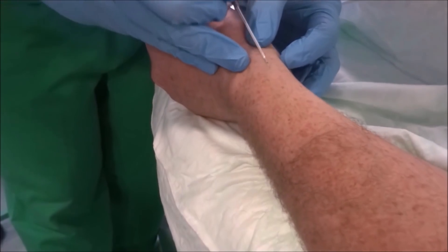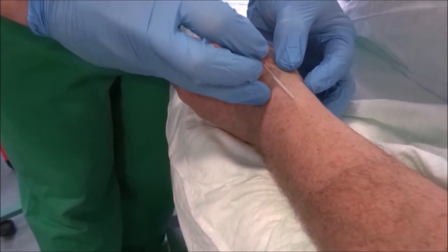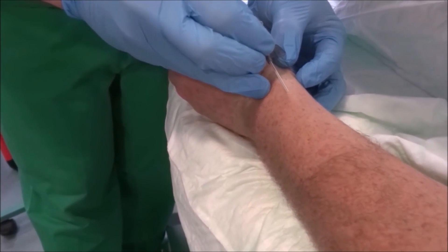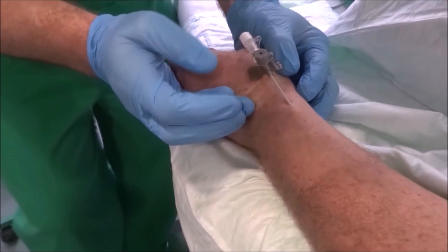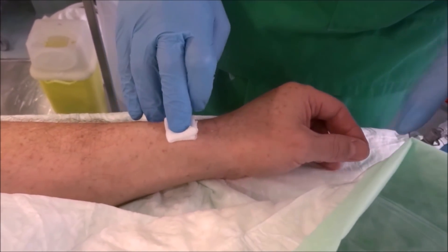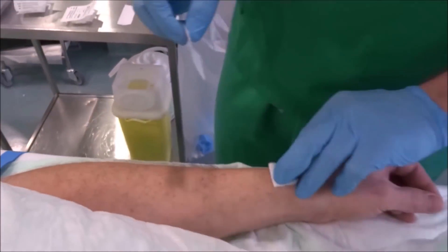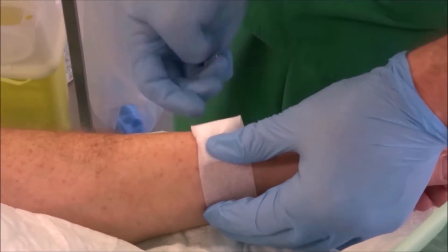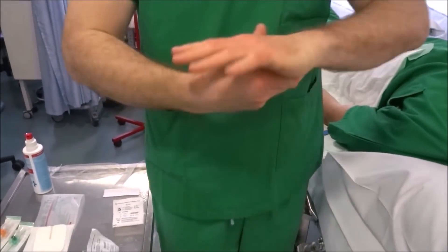We now insert the catheter. Here, we have to stop the process because the patient complains about sensory disturbances in the thumb. The strong twitching after the puncture also indicates the touch of a nerve. It probably touched the superficial branch of the radial nerve which is located along the vena cephalica. In case of a failure, we start again at point five.